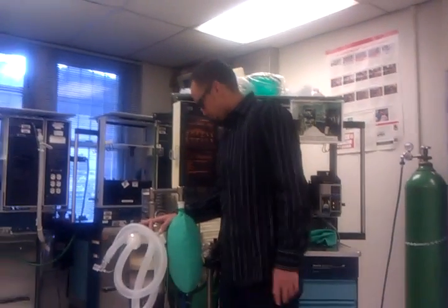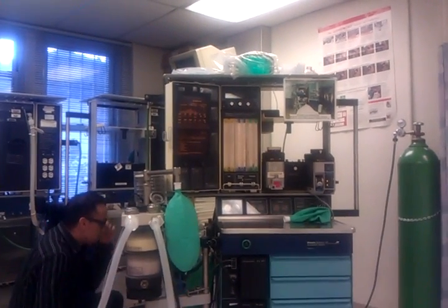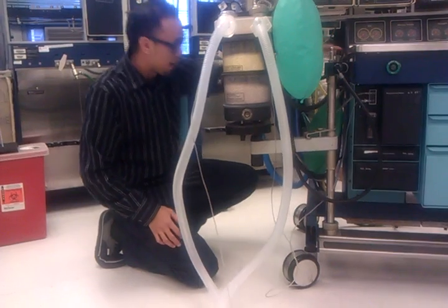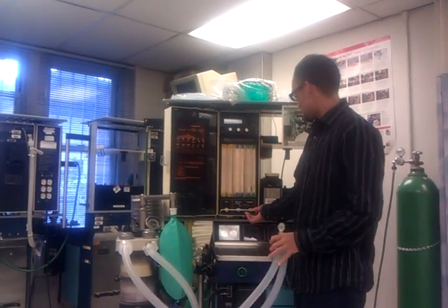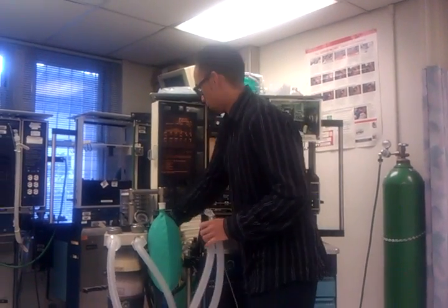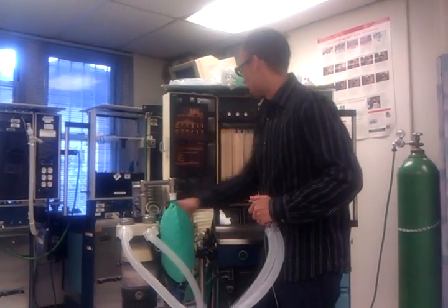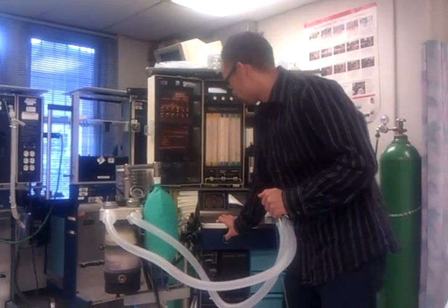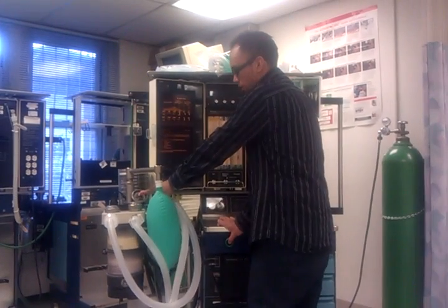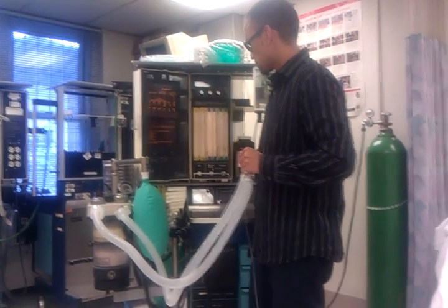I'm going to check my scavenger system. First I want to see if my APL valve is connected to my scavenger — which it is — and check my ventilator relief valve functioning. Set my waste gas vacuum to the adequate parameter. I'll put flow at 2 liters a minute, occlude the APL, and see if my pressure gauge reads at zero — indicating adequate vacuum — and the bag slowly deflates. I'll flush it to make sure the gauge reads below 10 centimeters of H2O, which it does, indicating a good vacuum of the waste gas.